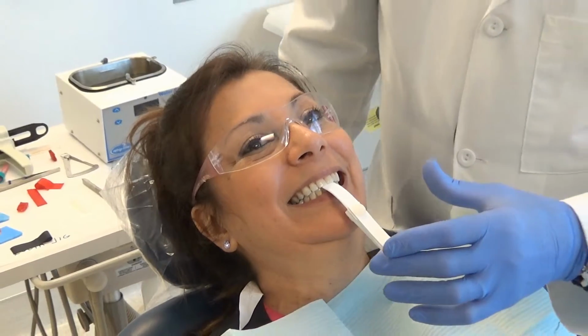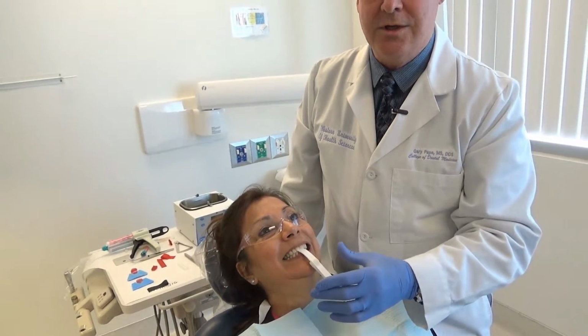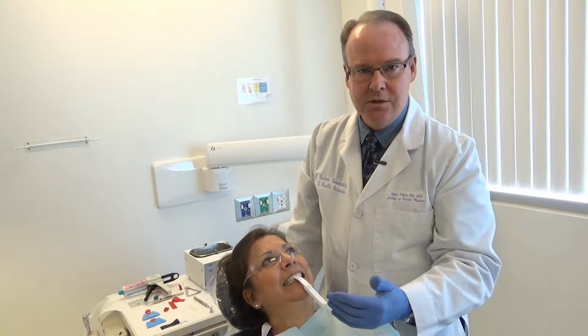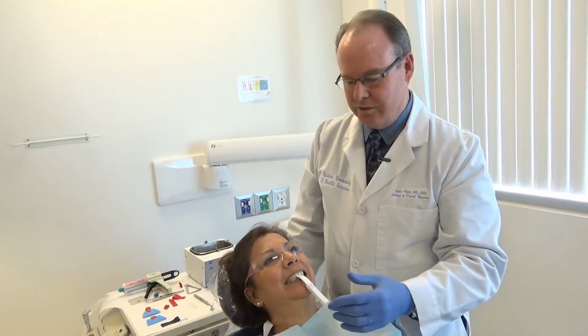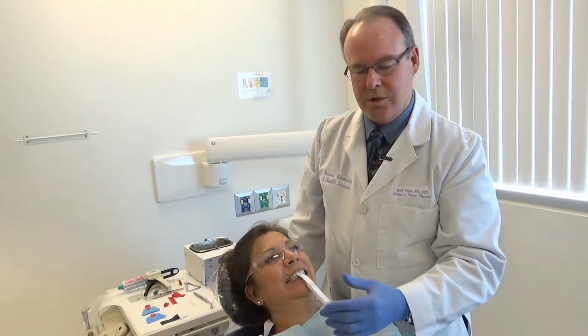And centric relation should always be taken with an open bite registration technique. It should never be taken with any teeth touching. If a tooth is actually touching, you might have a deflection, and the deflection would cause the jaw to position itself into an entirely different place than you're interested in evaluating when you do any of your occlusal analysis work.